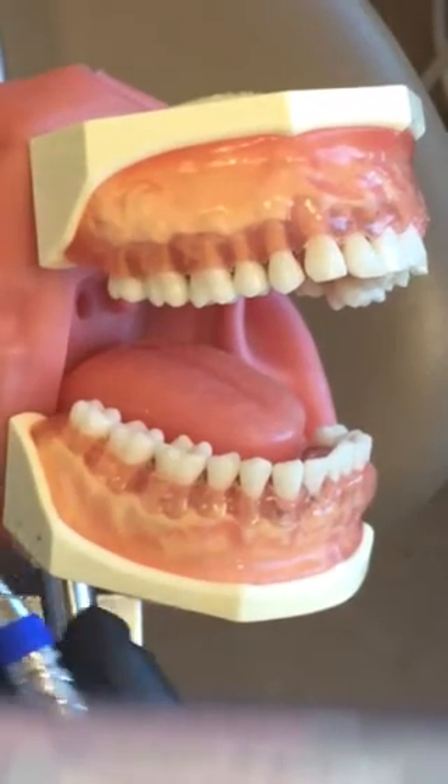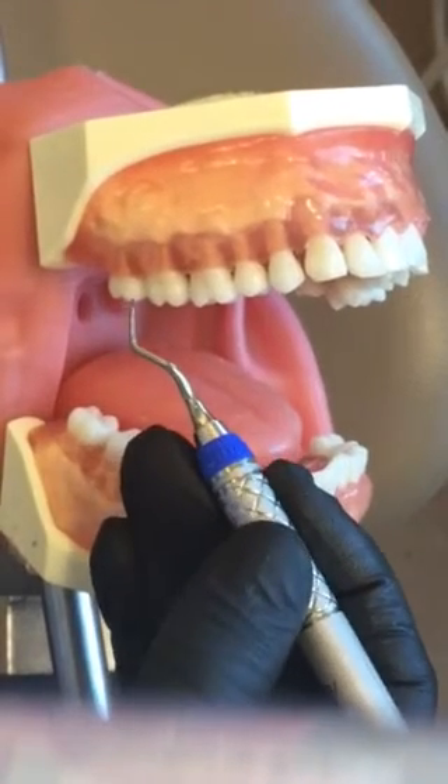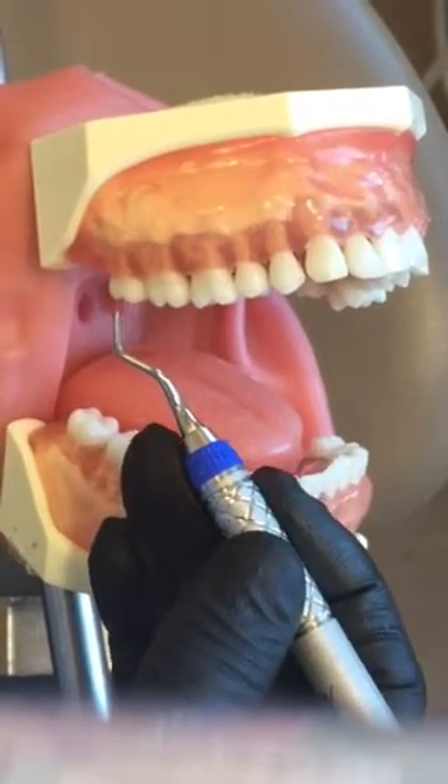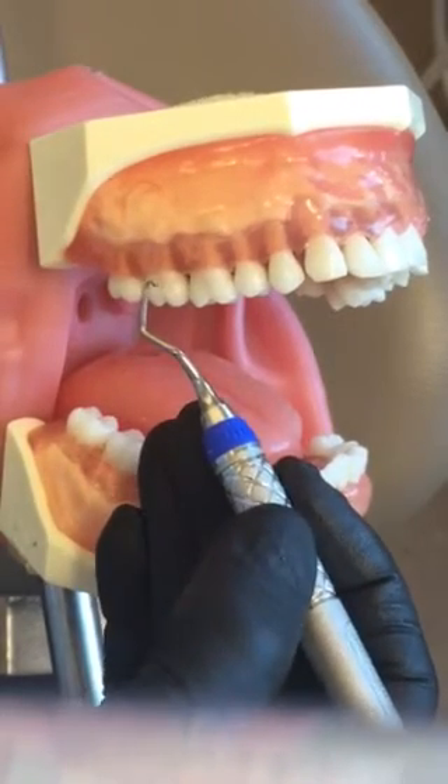Your Gracie 13/14 is an area-specific curette made for posterior teeth distals only. So what you're going to do first is establish which end is your correct working end.